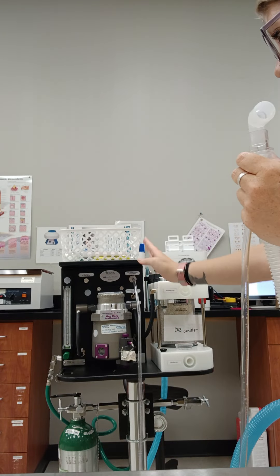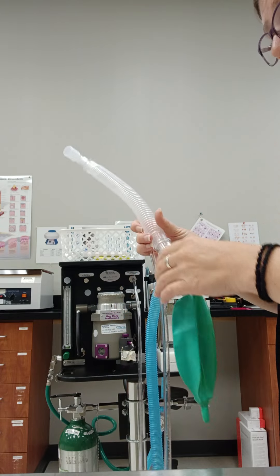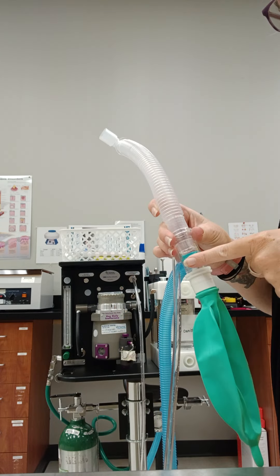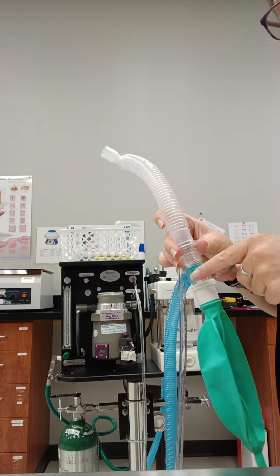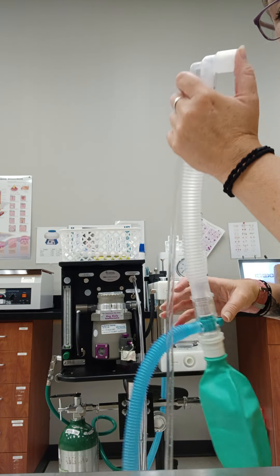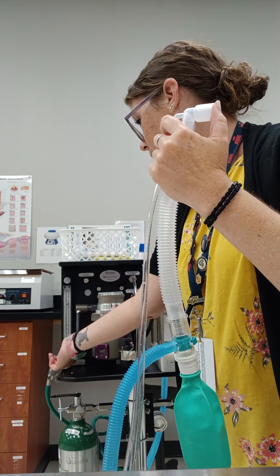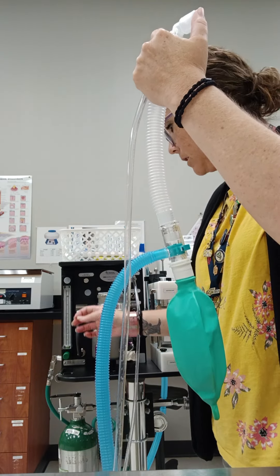This one is switched over to non-rebreathing. We've plugged it in. We've got our reservoir bag. Making sure that the valve is closed here — this is kind of like the pop-off valve for this type of breathing circuit. We're going to close off the end and turn on the flow meter. What we're looking for is for this bag to fill.